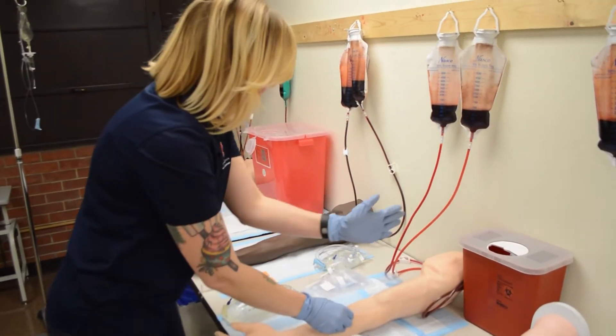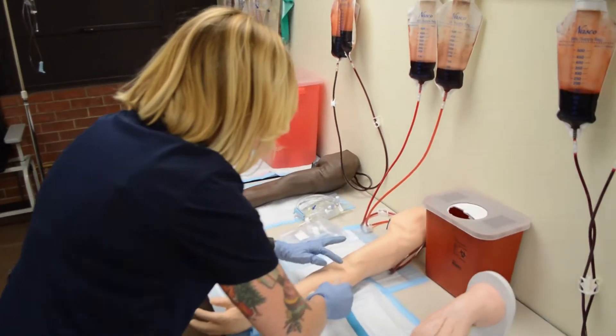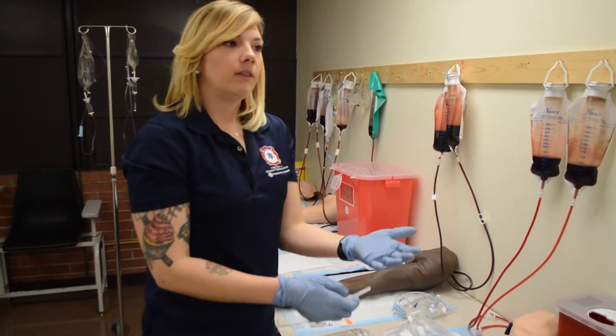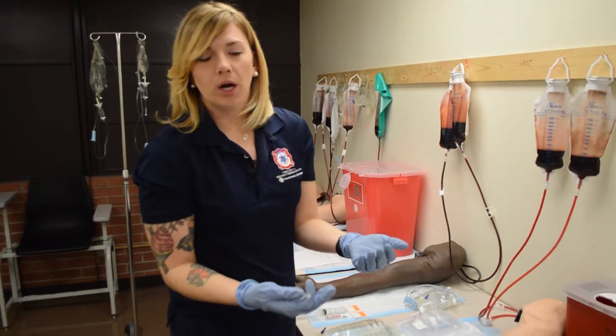If your patient is facing straight on, you should be facing straight on. If they're at an angle, you should be at an angle. You always want to be moving with your patient, not reaching over your patient or reaching over your hand. That will not only overextend you, but can cause pain to your patient or set yourself up for accidental sticks, which you don't want.